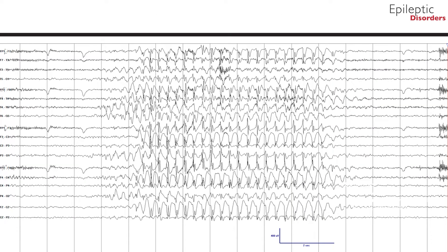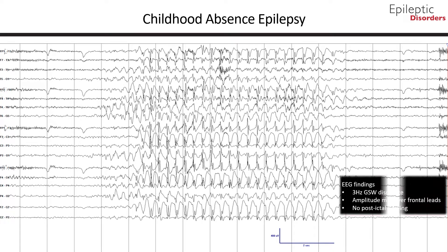This is a bipolar montage of a 7-year-old boy showing the typical pattern for childhood absence epilepsy, in which there is characteristic 3 Hz spike and slow wave discharges that appear maximal in amplitude over the frontal regions. Note how there is no post-ictal slowing after the 3 Hz spike and wave complexes.